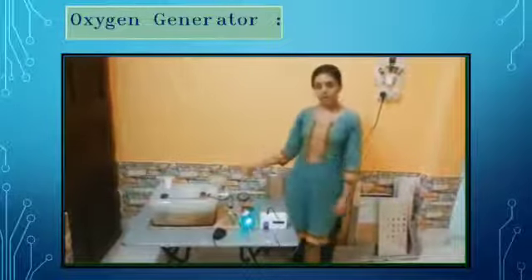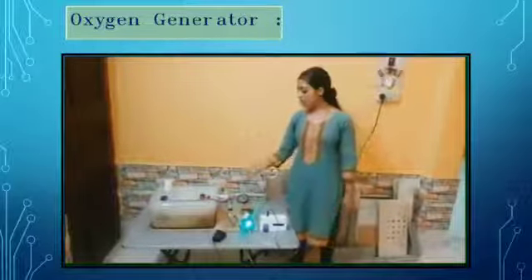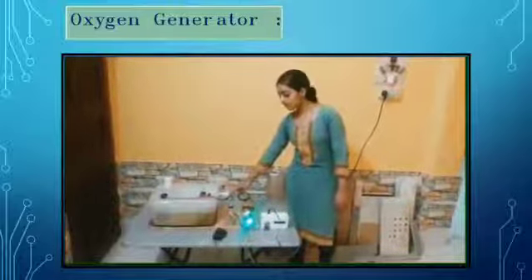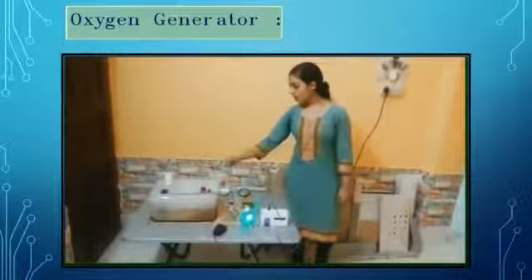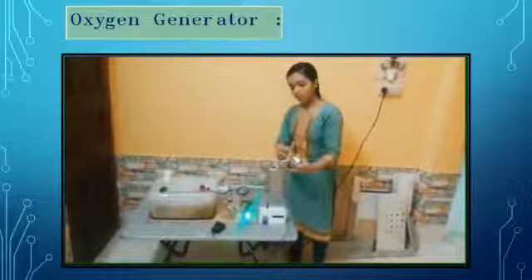For demonstration purpose, I am not using a water supply. But for using purpose, we have to use a regular water supply which would be connected to this pipe. Now, here is an oxygen mask which will be attached to the mouth of the patient. And here is an outlet for oxygen which comes through this pipe and the patient can take the mask and take the oxygen.